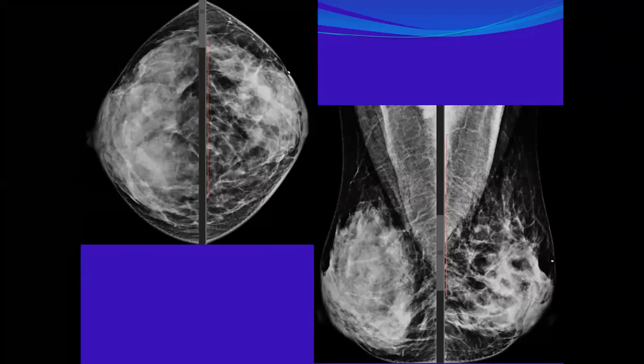What are the differential diagnoses of global asymmetry? Other differentials include renal failure, heart failure or liver failure. But why is it unilateral? It could be unilateral or bilateral. In case of unilateral, left-sided heart failure gives unilateral more than bilateral. Inflammatory breast cancer also could be unilateral, giving global asymmetry. Another differential diagnosis? Okay. What else? You are right.